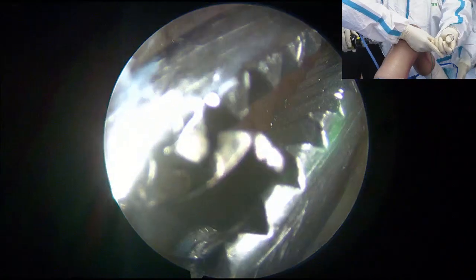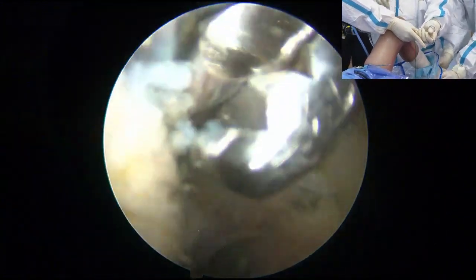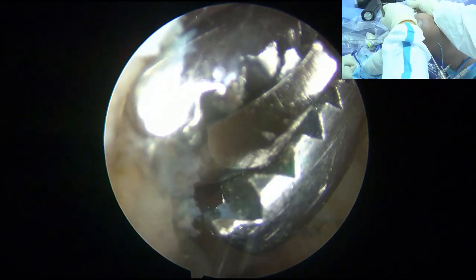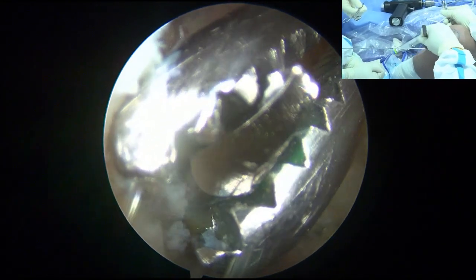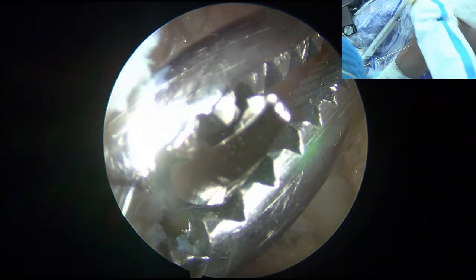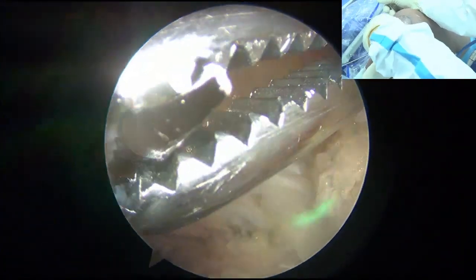So I put it in the center because then you have no second killer turn. If you come from medial, you have another curve, right? You have two angles. You go in this way and you go in this way. So you come from the center, you go this way, okay? Another thing is the central bone quality is good. So you can get a very strong fixation, okay? Because many times the PCL injury happens in trauma patients. Those trauma patients always have soft bone because they have tibia fractures, femoral fracture, hip dislocation, and immobilization for a while. So this kind of patient would have soft bone.